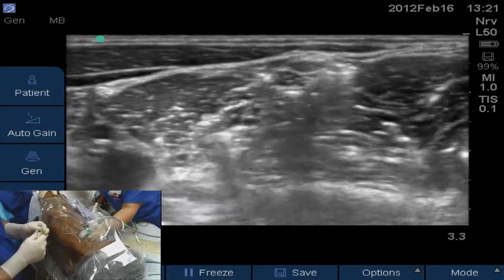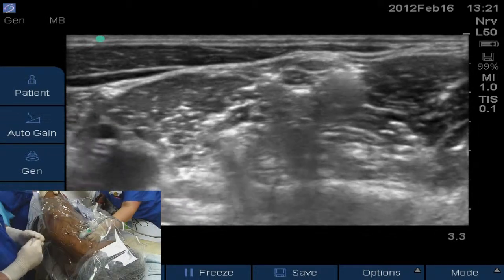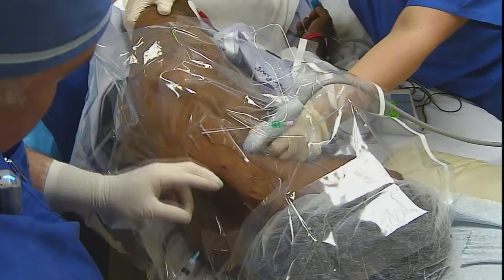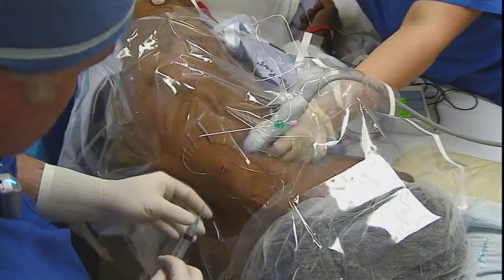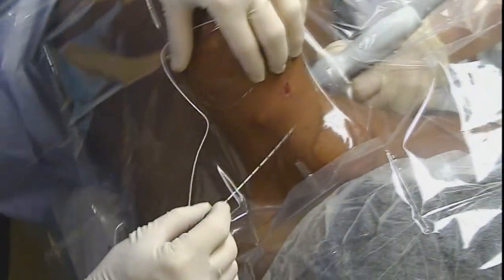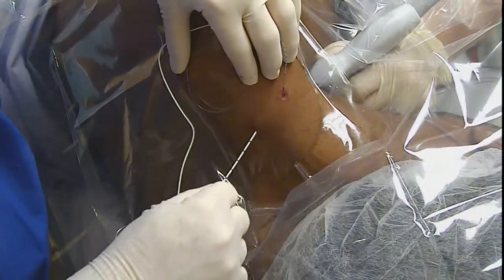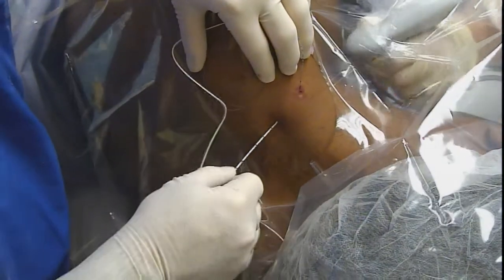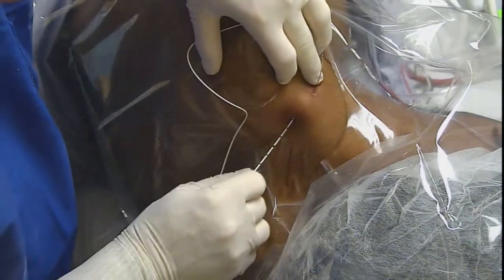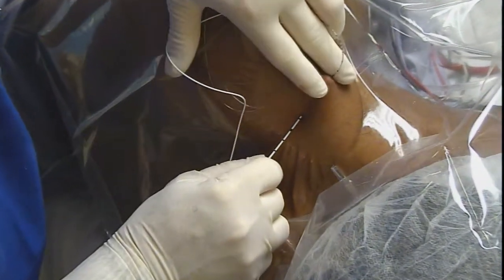Just posterior to the plexus, between the nerves and the middle scalene muscle. We'll do a little tunneling action. So we're bending our needle so we can do our tunneling — go out about three to four centimeters distal, just go sub-Q, turn the needle, and bring it back out.